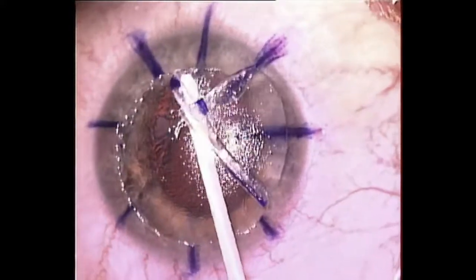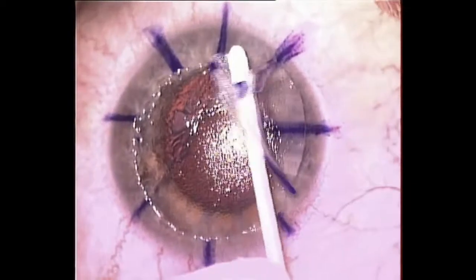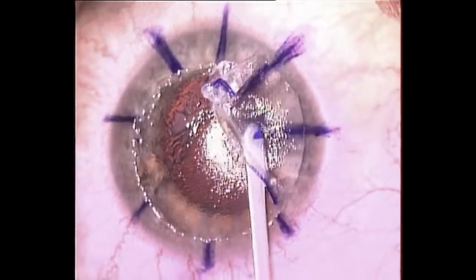In these cases, you need to elevate the flap, you need to clean the surface, you need to hydrate the surface with distilled water, and finally you have to suture the flap in order to avoid recurrences and relapses of this epithelial ingrowth. You see here how we have elevated the flap, and when doing that, we realize that there is a melting in one area of the flap that was affected by the epithelial ingrowth.